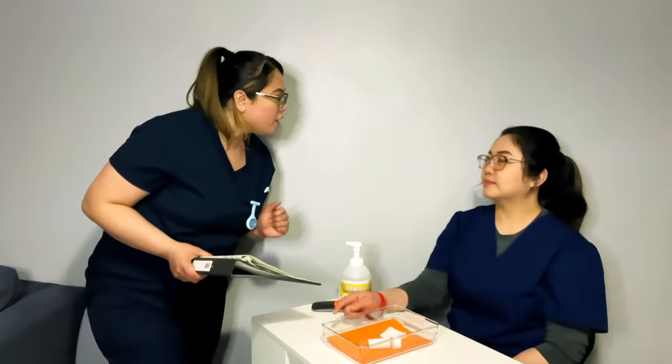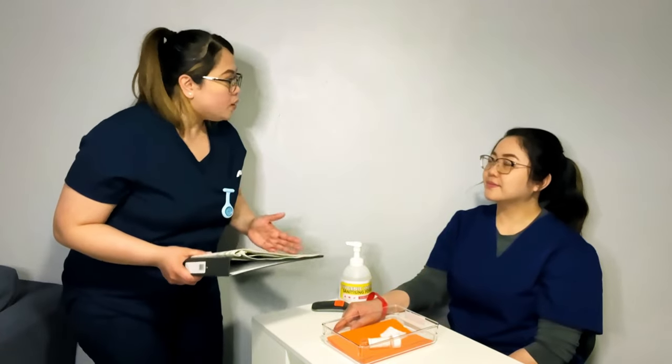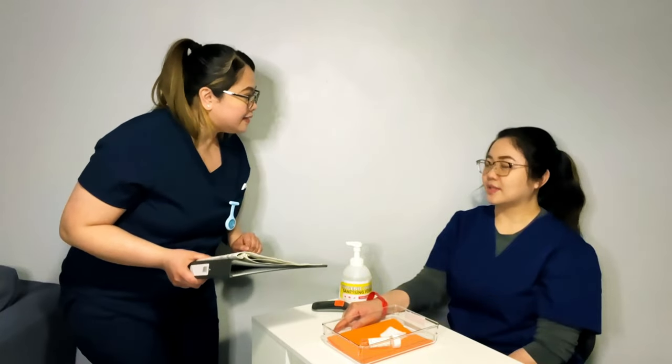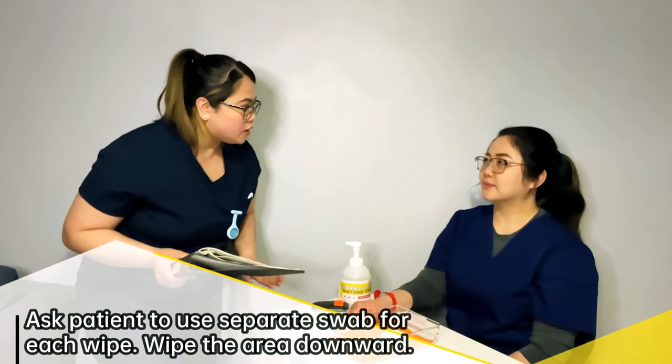Nelly, would it be okay if I call you Nelly? Yes. Yeah, okay. Nelly, what I'm going to need you to do is to part the labia and clean the meatus with soap and water, okay? Make sure to do it from front to back, okay? You have to use a separate swab for each wipe and wipe downwards, okay?